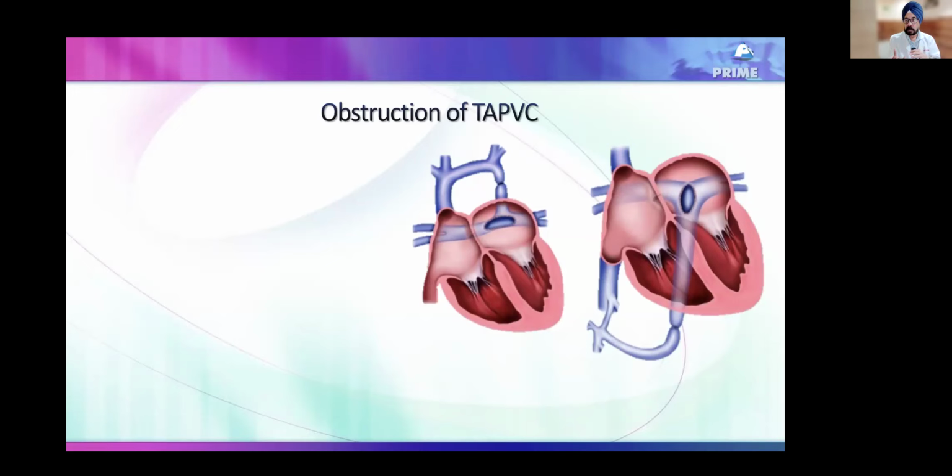When the child is born, the pulmonary artery suddenly grows big, and if there was no obstruction seen there, now you'll start seeing the obstruction. Okay, so supracardiac can get obstructed with this. There's no evidence of obstruction in fetal life, but at the level of the pulmonary artery, where it crosses, or at the level of fossa ovalis. So two places, even normally non-obstructive looking TAPVC can get obstructed.